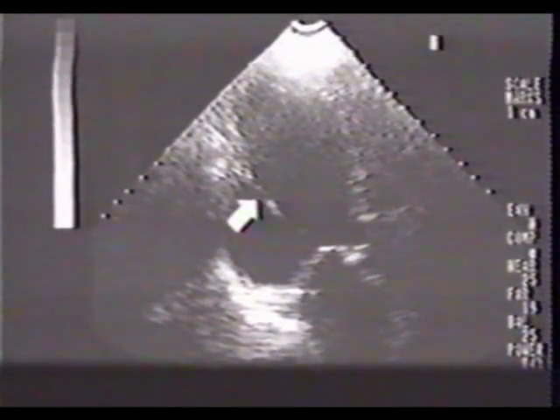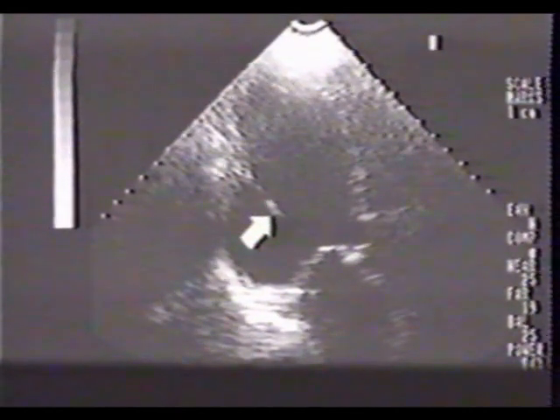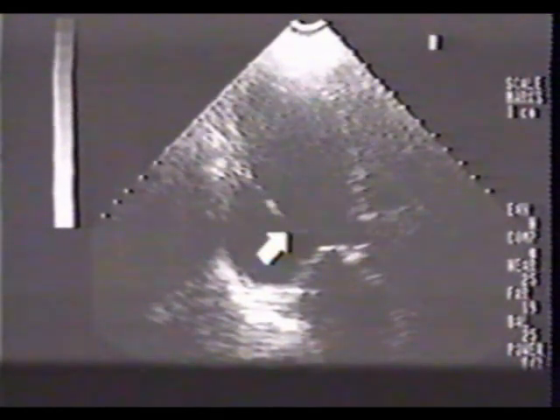This patient had prior apical and inferior infarcts. The inferior infarct has resulted in formation of an infrabasal aneurysm. The neck of this aneurysm is also wide, extending from the mitral annulus, here at the base of the posterior mitral leaflet, to the base of the posteromedial papillary muscle. You can see that the papillary muscle has also been infarcted. It is thinned, echodense, and stretched across the neck of the aneurysm.